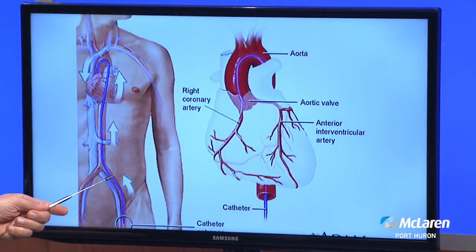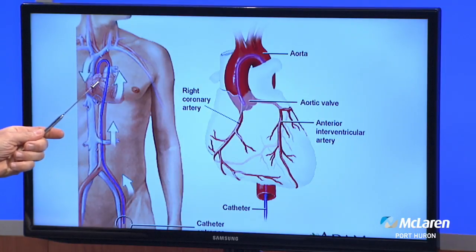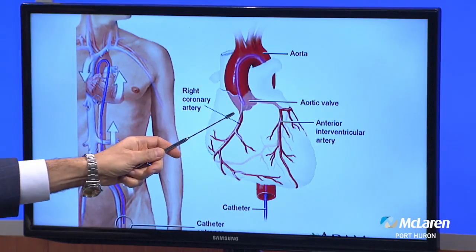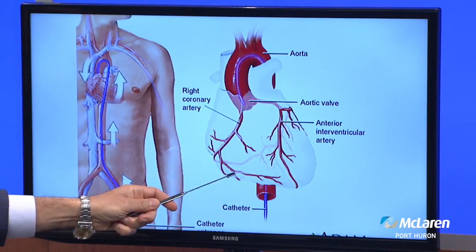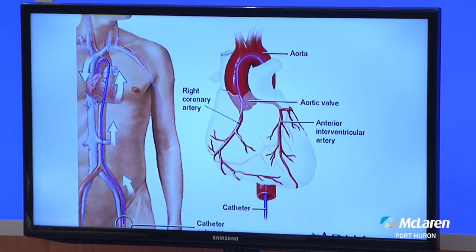A catheter gets threaded up to the heart, and we can see in the picture the route that we can take. This is a picture from the femoral artery. Our catheter is threaded from here, goes up, this is the blue one, goes all the way around and back to the heart. And we can see it here, going back to the arteries of the heart. As you remember, we talked about the one to the front and one to the back, and we have special catheters that we use to cannulate either one of the arteries. Once we take the pictures, that's the road map. We know where the blockage is, how severe the blockage is, and what we need to do about it. Once we do that, then we can get on and do the angioplasty.